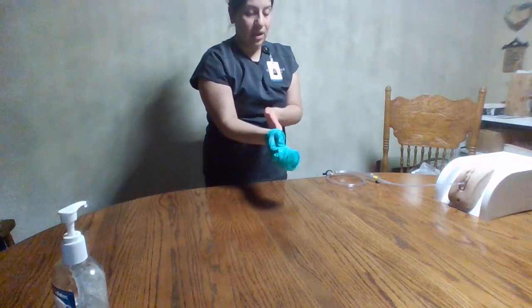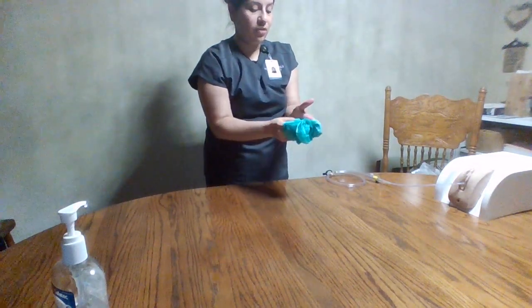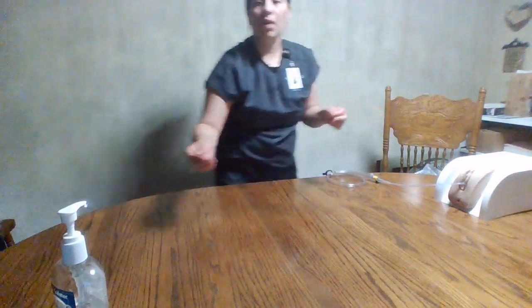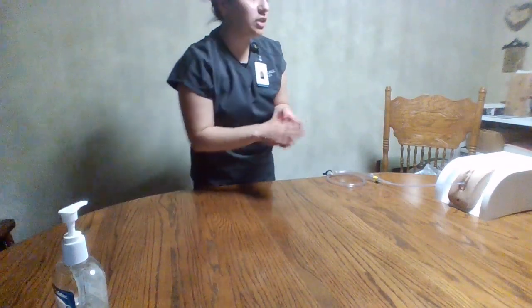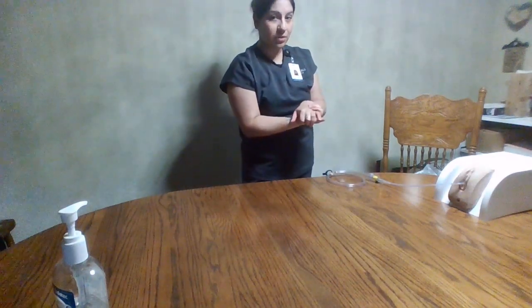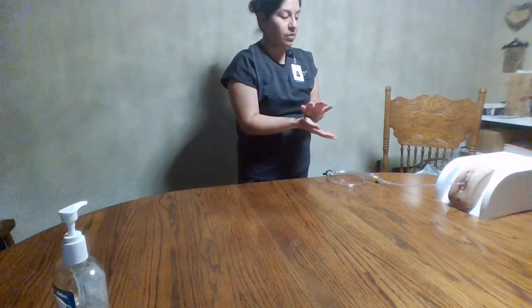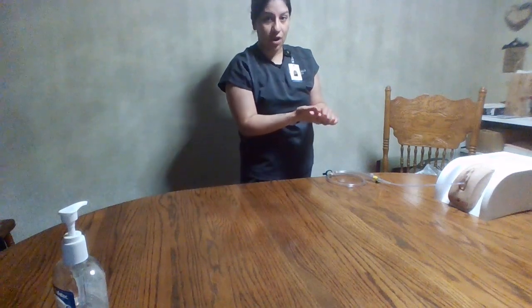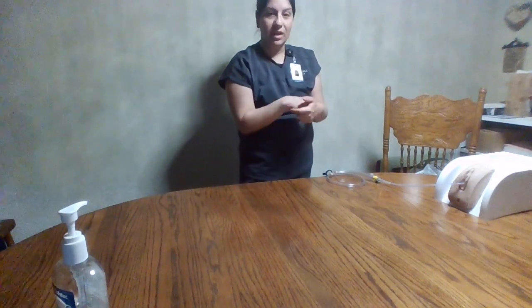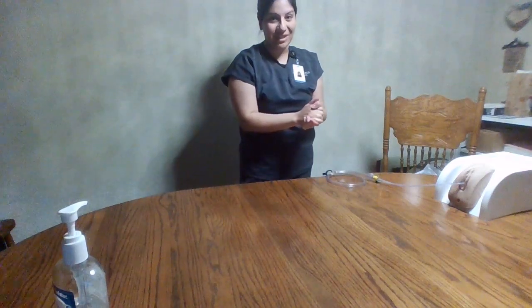I will go ahead and remove my gloves. Okay. I will perform hand hygiene. I will make sure that the patient is left in an upright, comfortable position. I will make sure that the patient's call light is left with them as well. I will then leave the room and document the procedure.